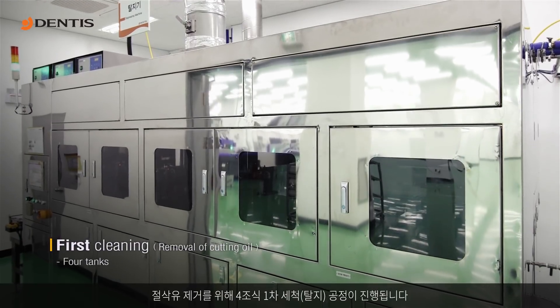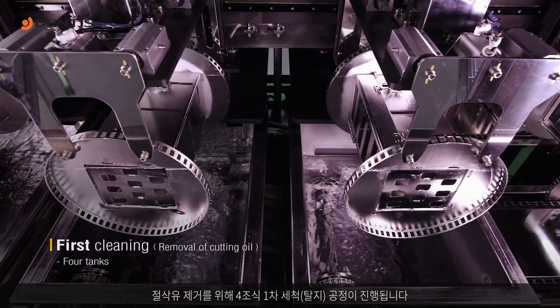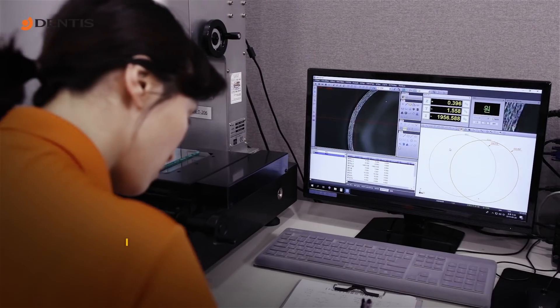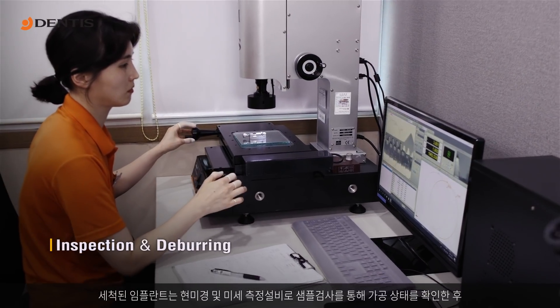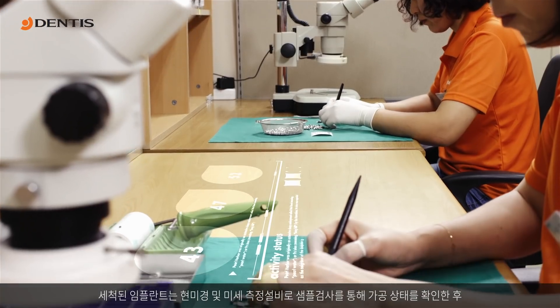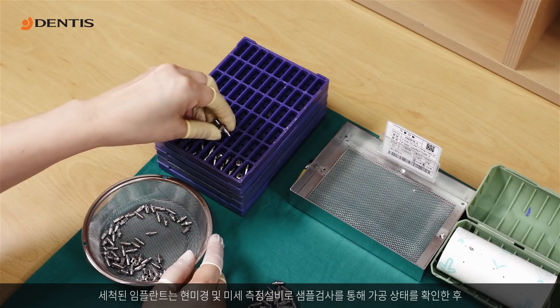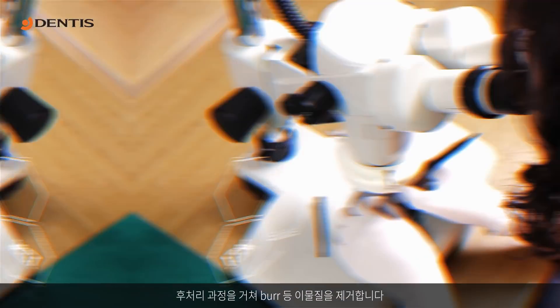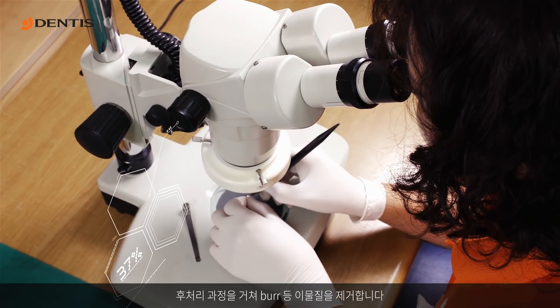The first cleaning, in four tanks, is done to remove cutting oil. A sample of the cleaned implants is inspected under a microscope and by precision measurement equipment. The deburring process is done to remove foreign substances and imperfections.